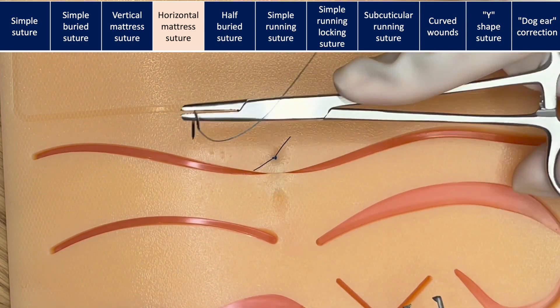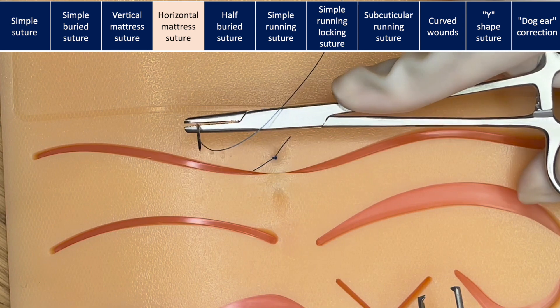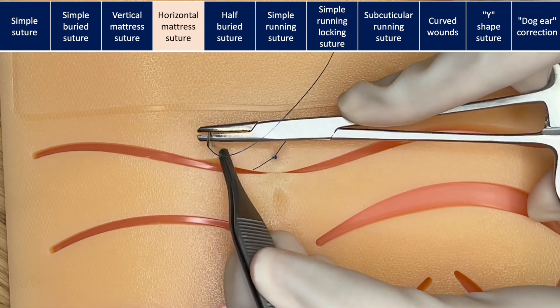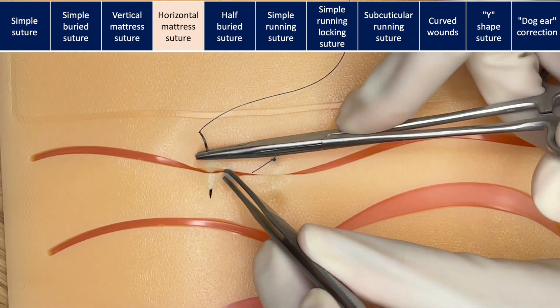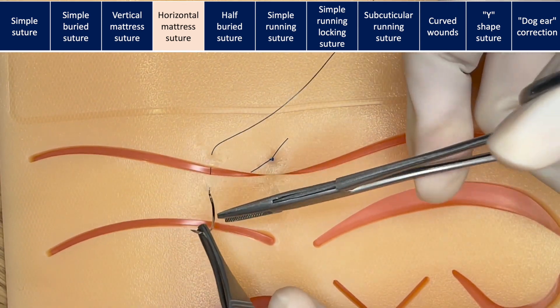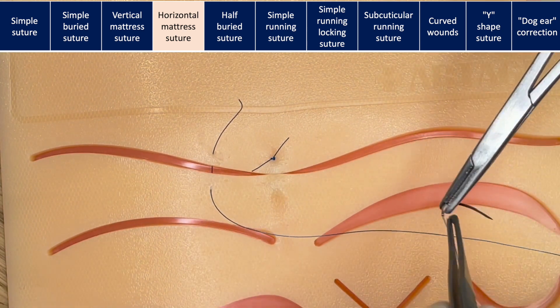A horizontal mattress suture is where two stitches are placed in the same horizontal plane next to one another. You can think of this as two simple sutures. You'll enter the skin as if for a simple suture. It is important that you are the same distance on both sides. You will take your bite on one side and then the other side.